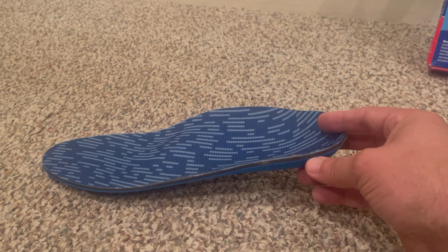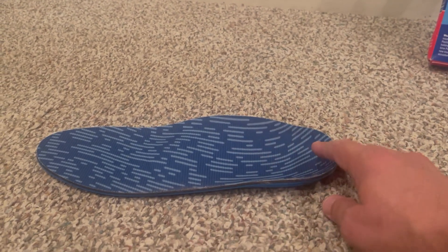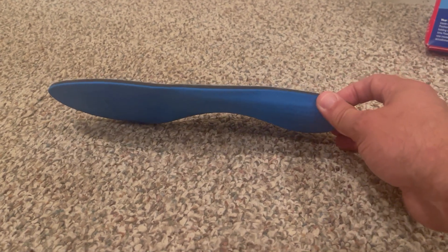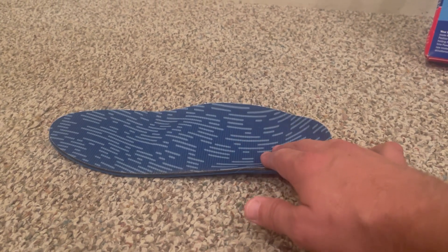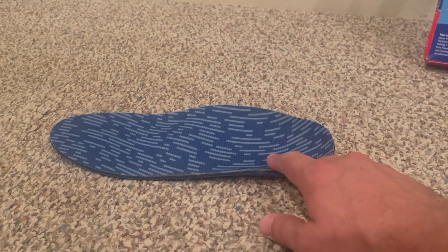I'm loving just the different features about it. This product is called the Pinnacle Power Step. There are two different types: one is just the regular Pinnacle Power Step, and the second is the Pinnacle Power Step Plus. This one here is the Pinnacle Power Step Plus.